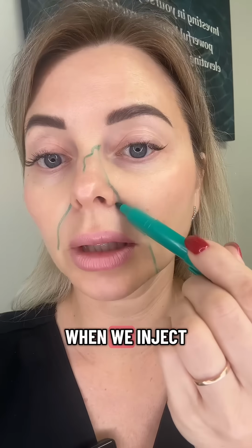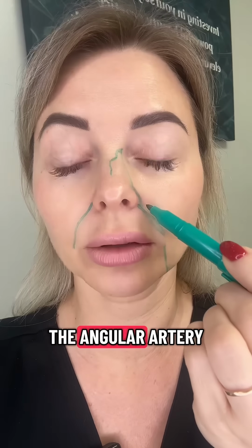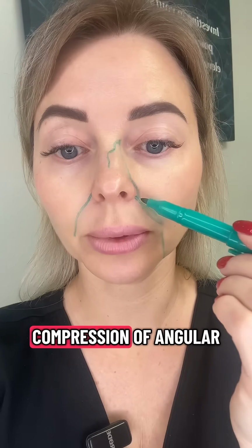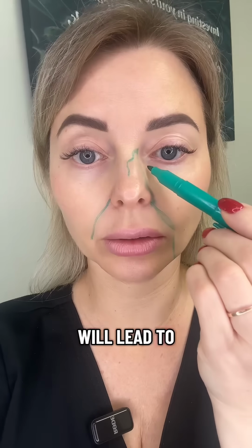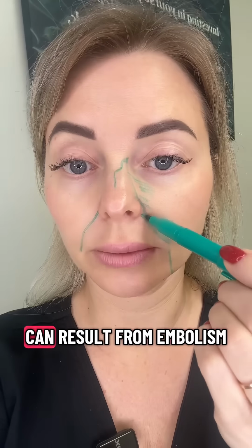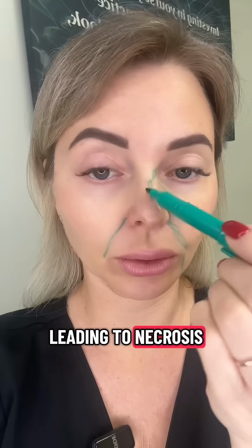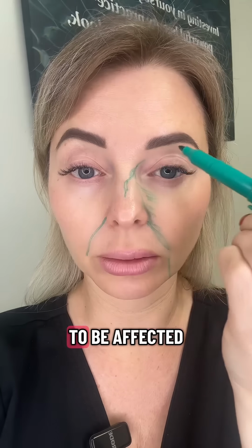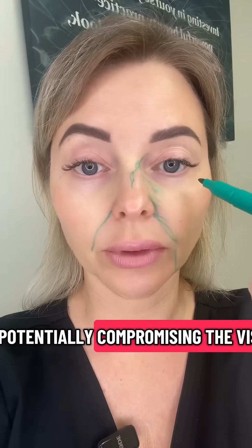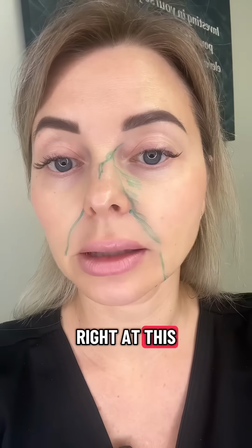The problem is when we inject in nasolabial folds, we come in very dangerously close proximity to the angular artery, which here can have variable pathways. Compression of the angular artery here will lead to necrosis of all the areas that it supplies. Even worse complications can result from emboli, because that can travel along the dorsal nasal artery, leading to necrosis of the nose, or even affecting some of the areas of the ophthalmic artery and potentially compromising the vision.